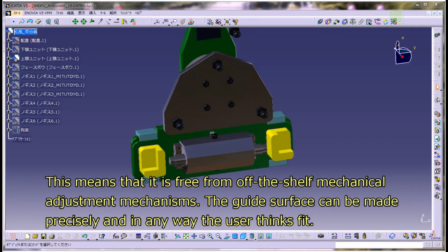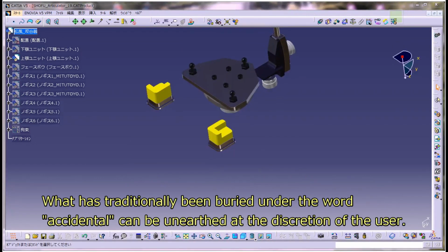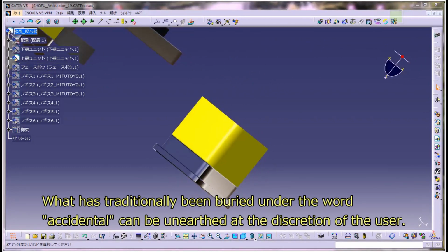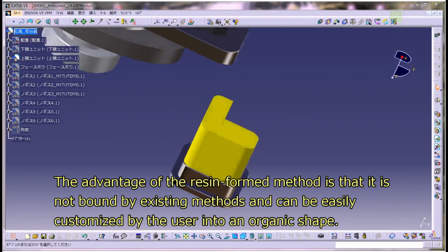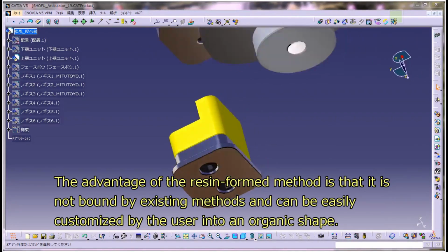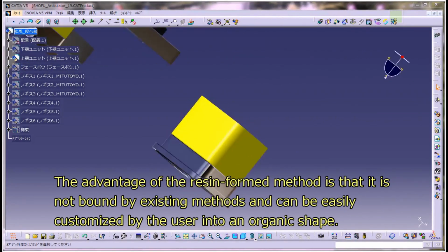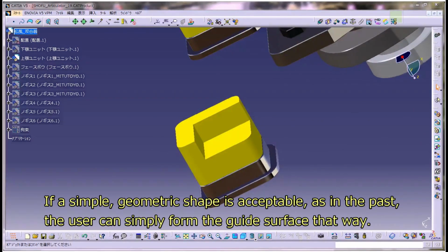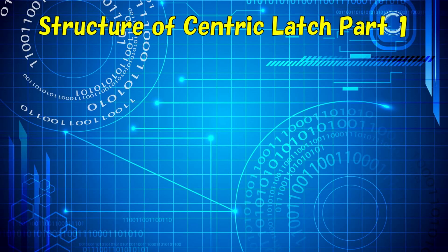The guide surface can be made precisely and in any way the user thinks fit. What has traditionally been buried under the word accidental can be unearthed at the discretion of the user. The advantage of the resin-formed method is that it is not bound by existing methods and can be easily customized by the user into an organic shape. If a simple, geometric shape is acceptable, as in the past, the user can simply form the guide surface that way. Structure of centric latch Part 1.